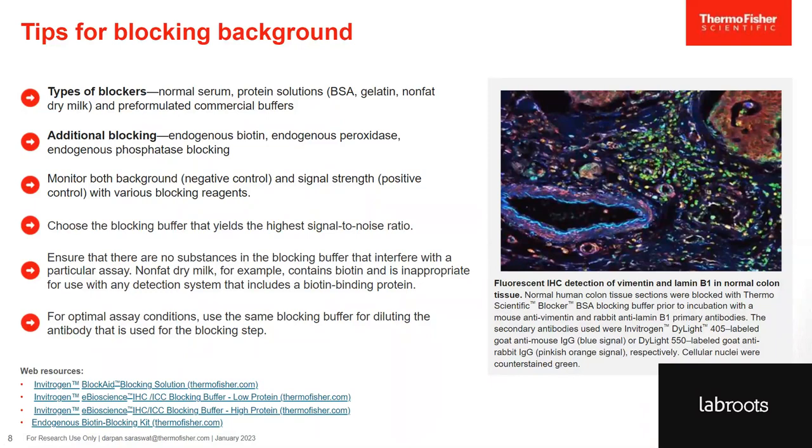Please make sure when you are blocking your samples to check the negative control and the positive controls with various blocking reagents, and choose the right blocking buffer that yields the highest signal to noise ratio. Make sure your blocking reagent does not have any component which will interfere with your assay.